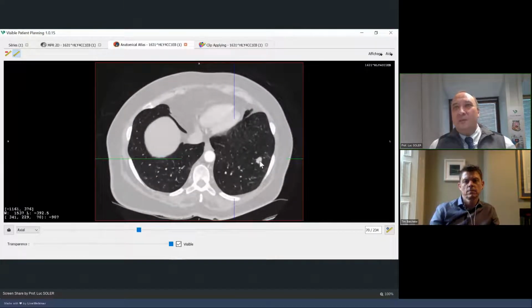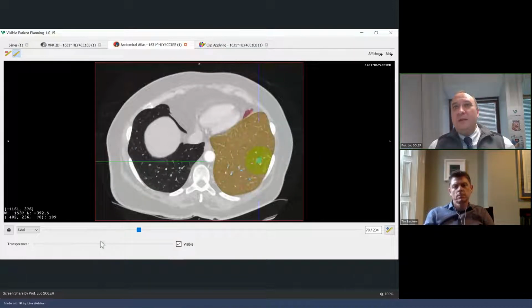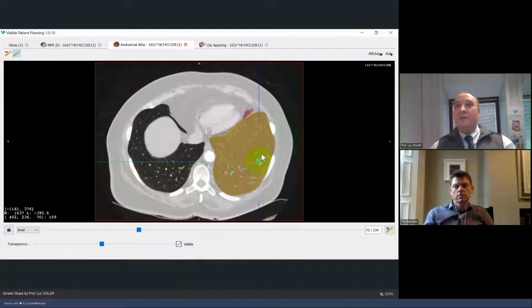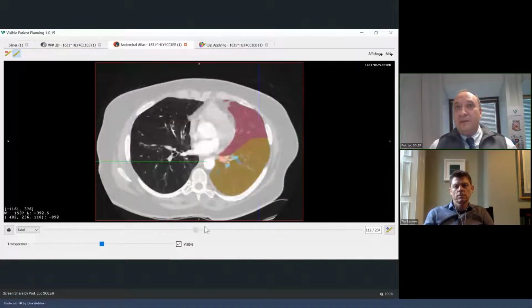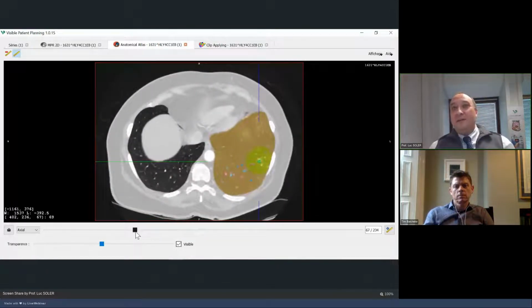You clearly see here the tumor located in this part of the lung. The first thing that the software can provide you is a colored image where you can see the tumor in green and the security margin in yellow. It's really important because during the previous presentation you heard teams explain that there is the problem of recurrence, and the recurrence is partially due to the fact that we can't necessarily guarantee the security margin around the tumor. You see here that we can see the security margin. But this nice image, for me, is not so nice for a simple reason. It is a set of slices.